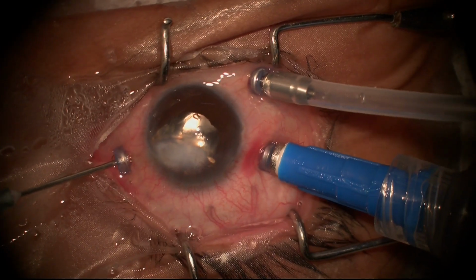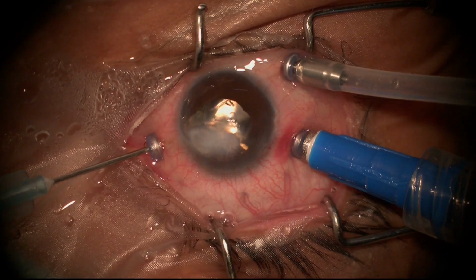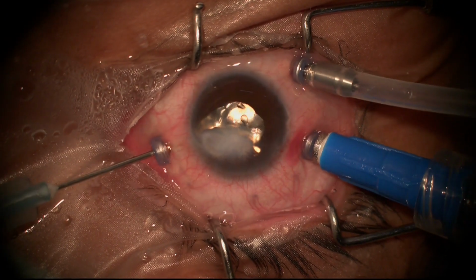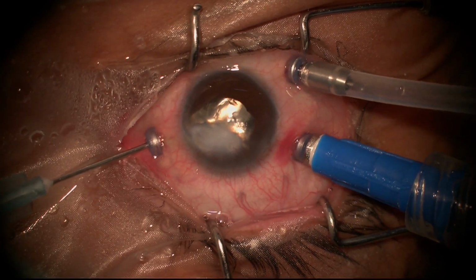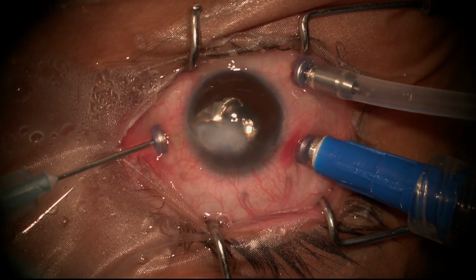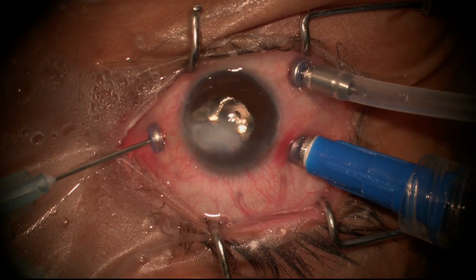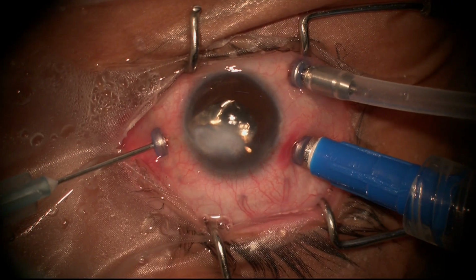This is like a short tonometry, indentation. You indent and you know how much force you require to indent the globe. And if it is more than what you expect, that means the pressure is on a higher side. So this is all more like intuition, less like any measurement technique. Right now we don't have any tool to measure the intraocular IOP during surgery. There's no way.